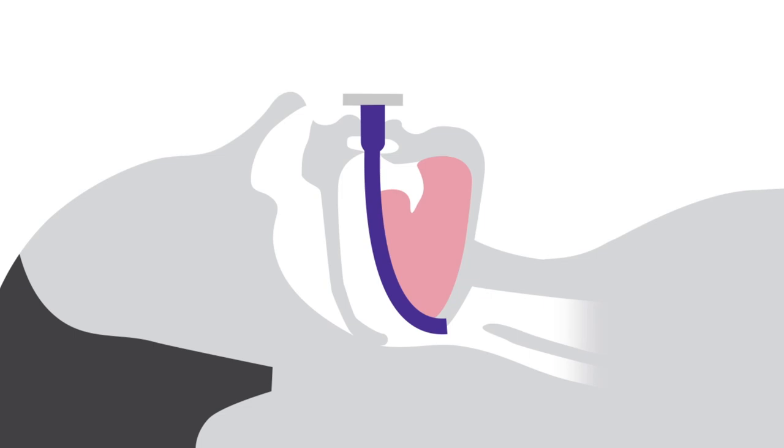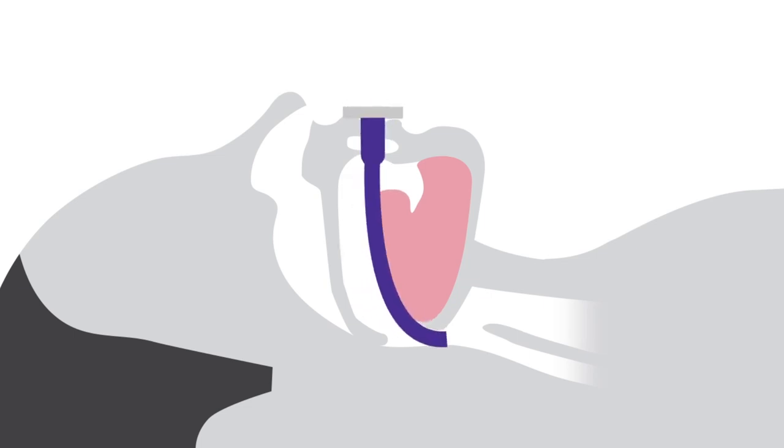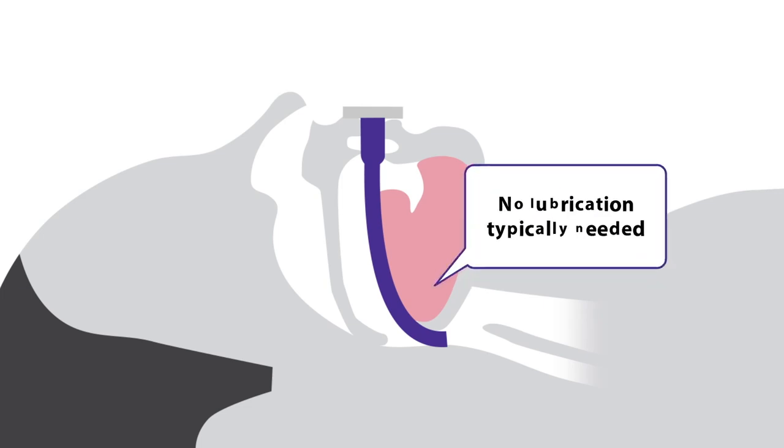If measured too long when sizing, withdraw until correctly placed. Keep some molars on bite block. No lubrication, rotation, or tongue depressor is needed.